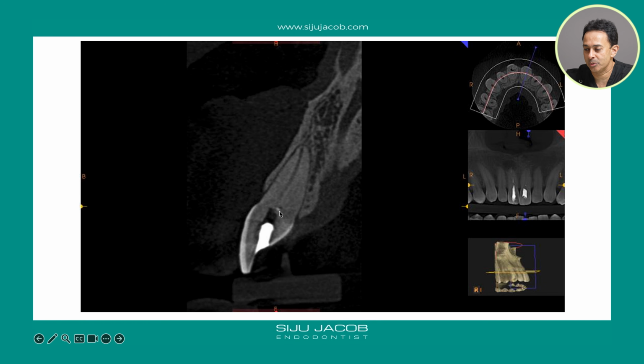So this was a good decision to put gutta percha here and then expose a cone beam CT, because what it told me was to look labial to where I was drilling. Because if I didn't have this information, then I would have gone on drilling down here and I probably would have perforated palatally. So this gives me a clue that wherever I've put the gutta percha, the actual canal is labial to that gutta percha.